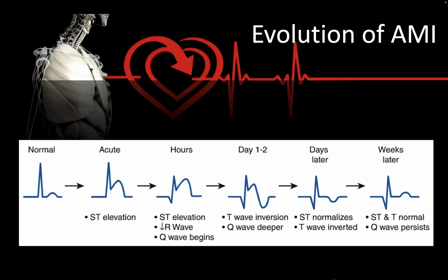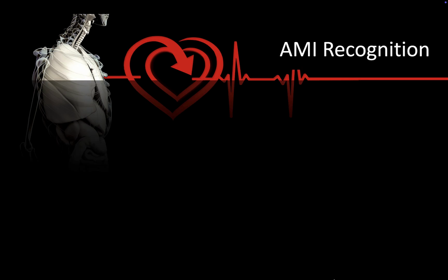This slide just captures the progression that I just went through in one single view. If you want to pause, you can look at that. And when we talk about AMI recognition and the criteria we need to use on our 12 lead to make that diagnosis, there's some variation around the country in different areas, different cath centers, different EMS protocols.